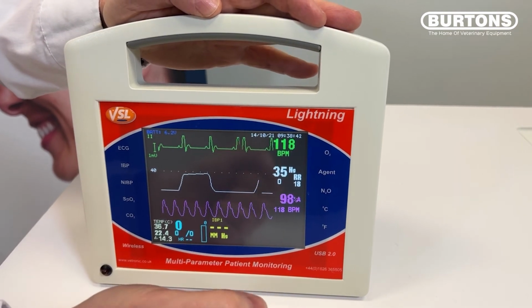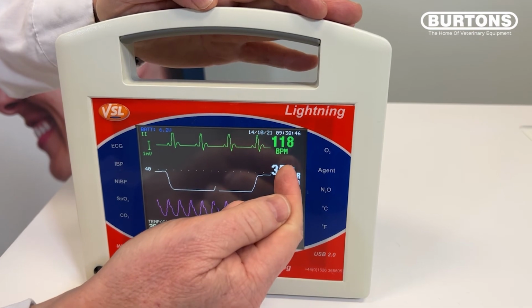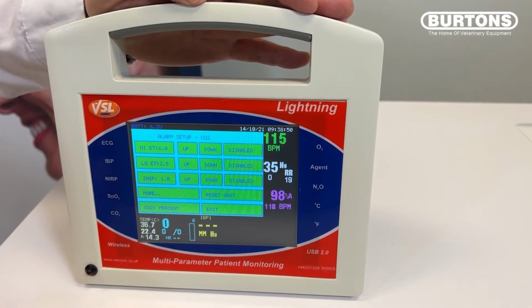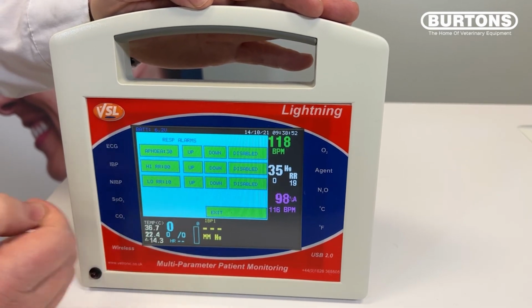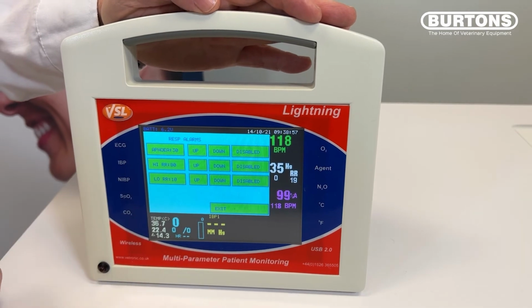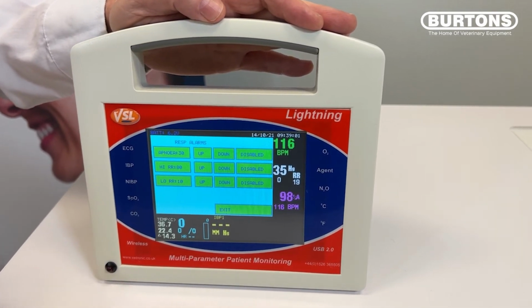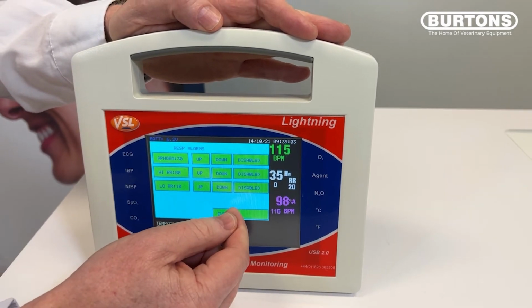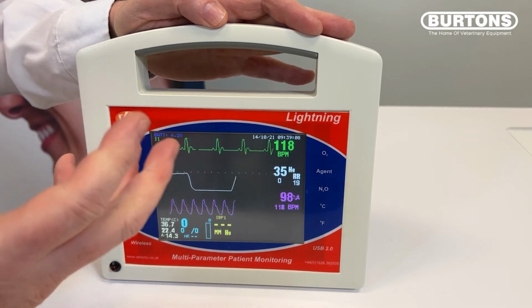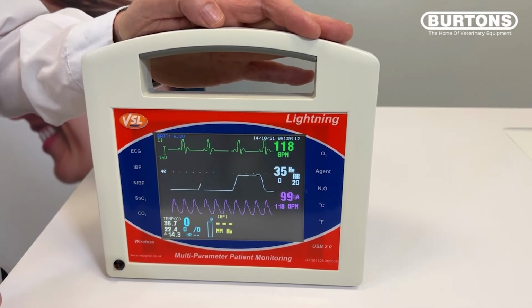On the number side, just to improve understanding and clarity, again, if we go into here, we can change things like whether we're looking at millimeters of mercury or percent. And again, on our extended features, we can change the apnea alarm limits, all the high and low respiratory rate limits. So in this manner, any position or appearance of the data can be changed just by a simple screen touch.